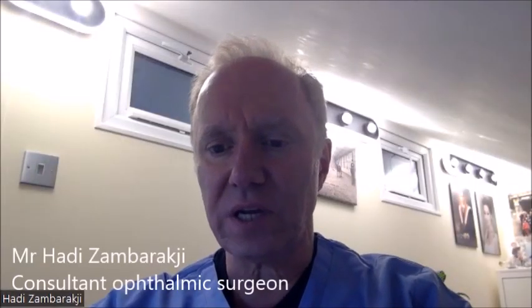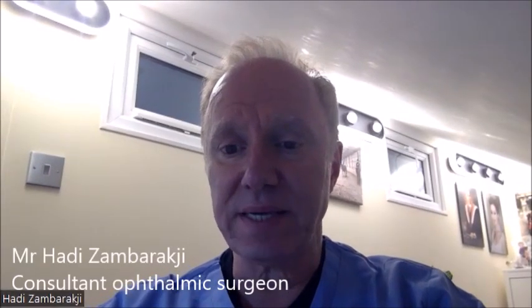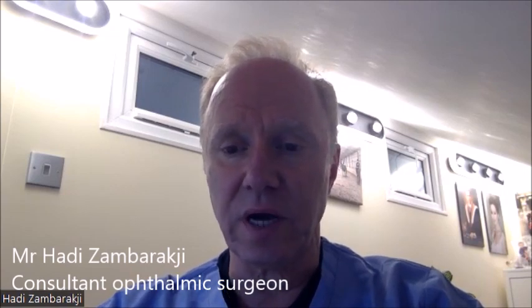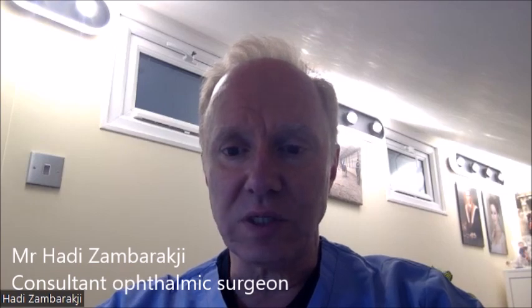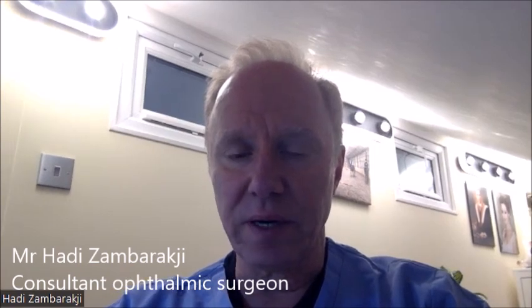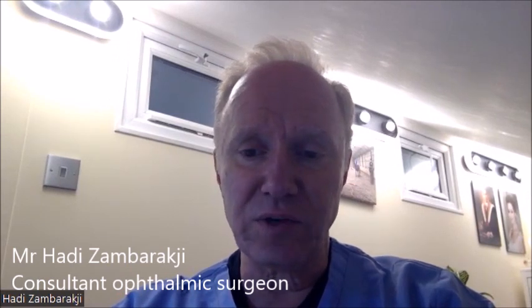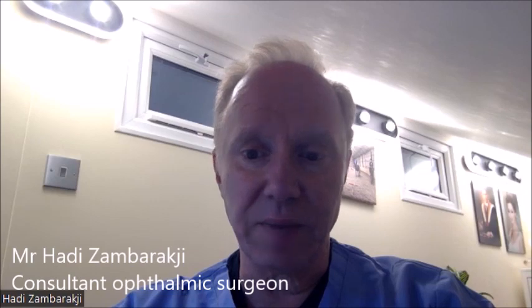So an intraocular lens implant is basically an artificial lens that is designed to be inserted into the eye at the time of cataract surgery. All it's doing is basically the same as what a natural lens would be doing, except that artificial lens implants are never the same exactly as the natural lens.